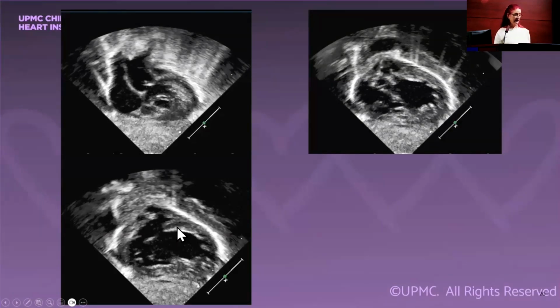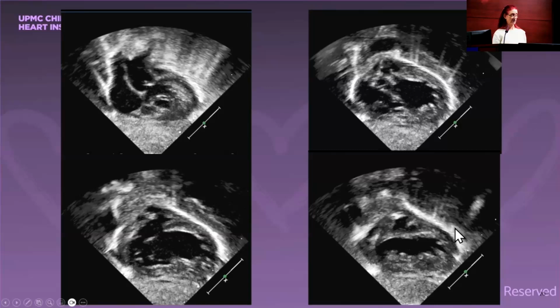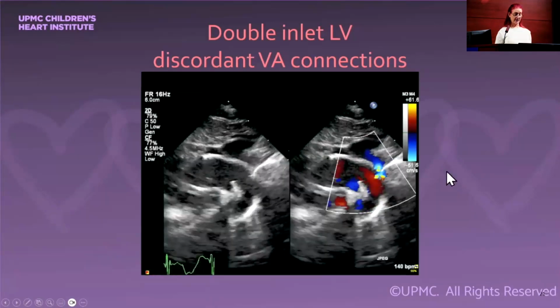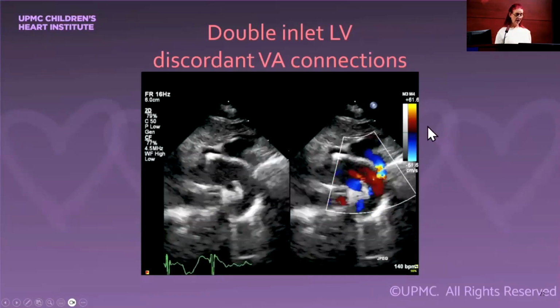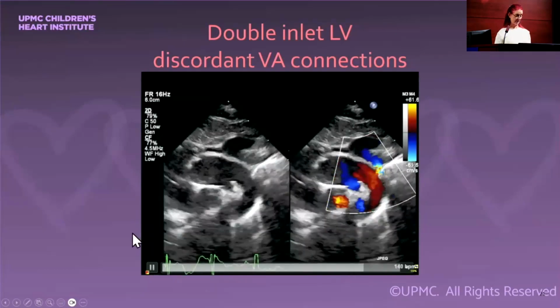It typically in the double inlet left ventricles has this horizontal course. Here's the VSD. And if we go all the way anteriorly, and again, you will not see this chamber unless you sweep all the way anteriorly till you've essentially lost the heart. You can see here is the septum. So here you can clearly see the more inferior LV and then the more anteriorly, superiorly anterior RV, which we classically see in double inlet. And just to verify, given that we had a small VSD and small aortic valve, again, severely hypoplastic aortic arch, ductal dependent for systemic blood flow.